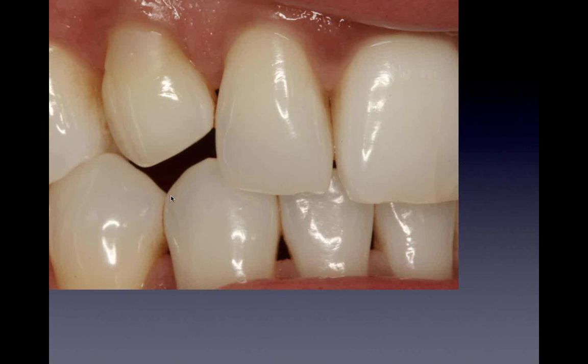But for the bite and for the occlusion and for the excursions, it's very critical, especially on a deciduous tooth on a 35-year-old female. We don't want to put any pressure at all on this tooth, otherwise we'll lose it. She's been holding on to it for these years because she had no occlusion on it and because it's not in excursions. So we don't want to add to it and then start another problem and possibly lose the tooth and possibly crack it. So we want to be really careful about this.